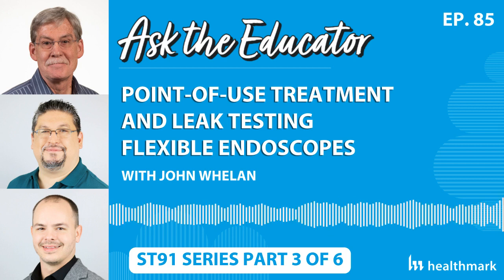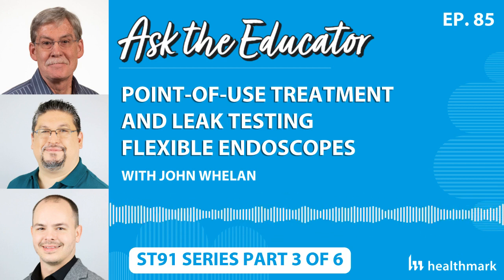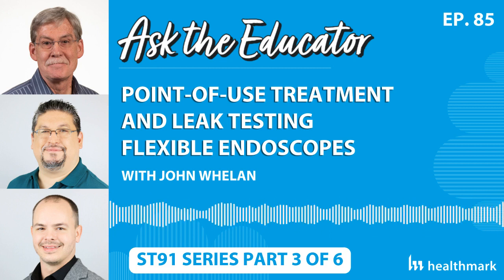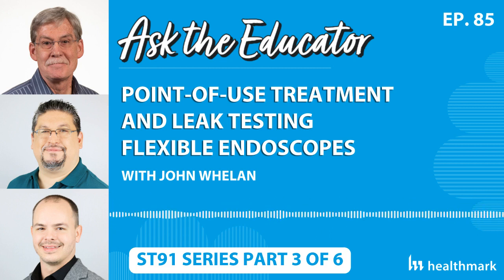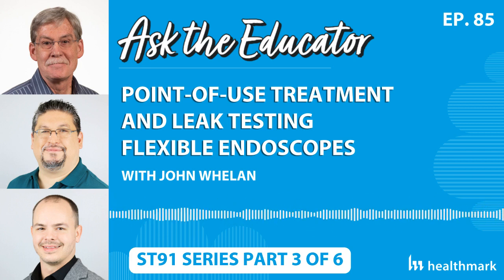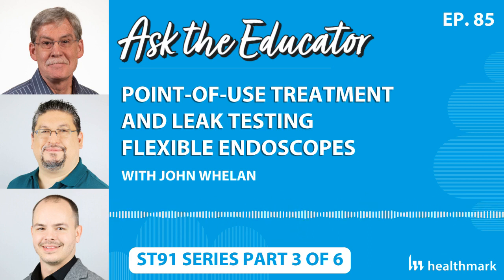Yeah, and being that this is my first time talking about ST91 on these podcasts, I just want to reinforce that this is not an update to a previous document, but rather it's a complete new document. So what people need to have in their possession moving forward and reference is the 2021 version of AAMI ST91. So when it comes to point of use at the bedside, one of the biggest changes is we introduced the term point of use treatment.